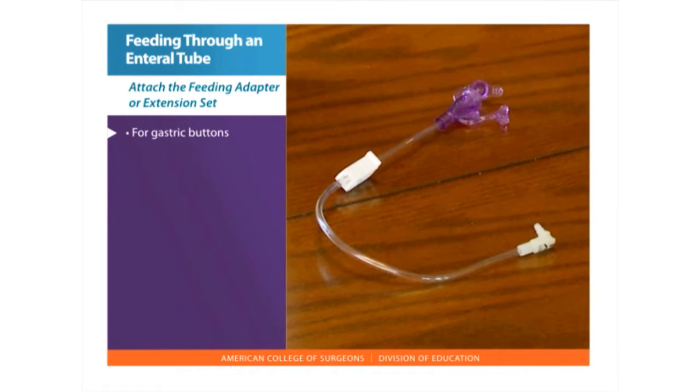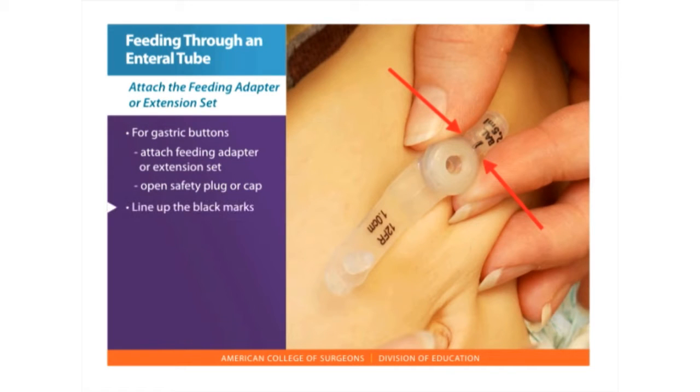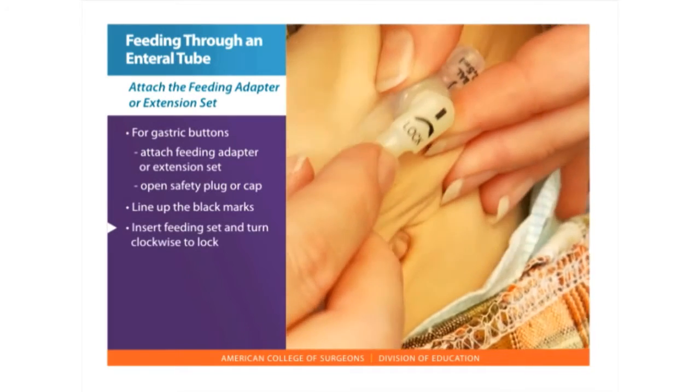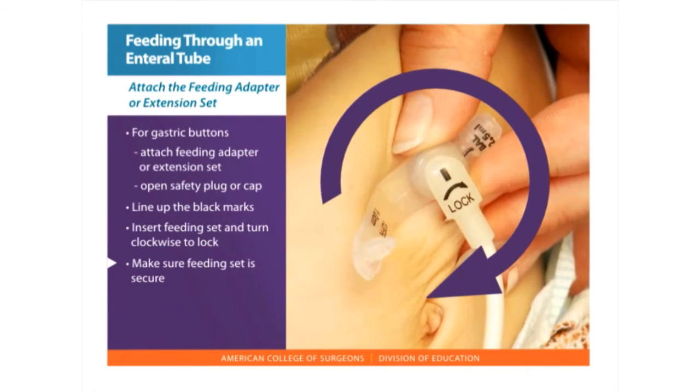Start by washing your hands with soap and water. For gastric buttons, attach the feeding extension set. Hold the button firmly and open the safety plug or cap. Line up the black marks on the end of the extension set with the marks on the feeding cap. Insert the feeding set and turn clockwise to lock, about a three-quarter turn. Check to make sure the feeding set is secure.